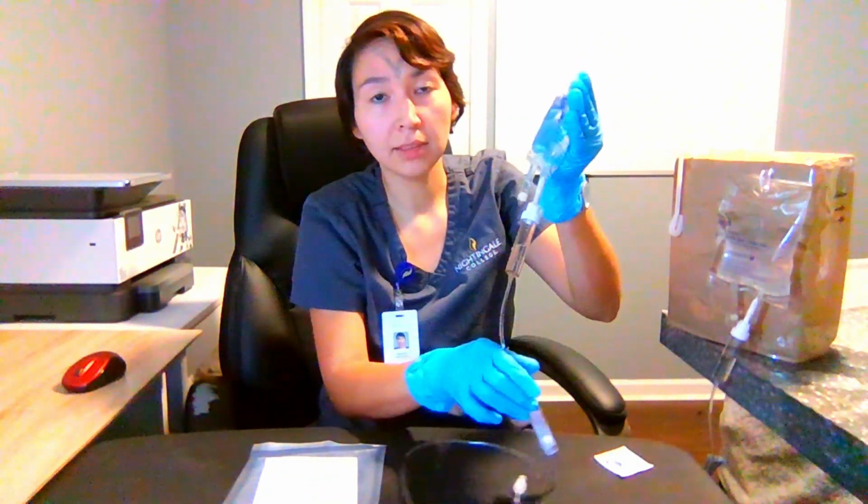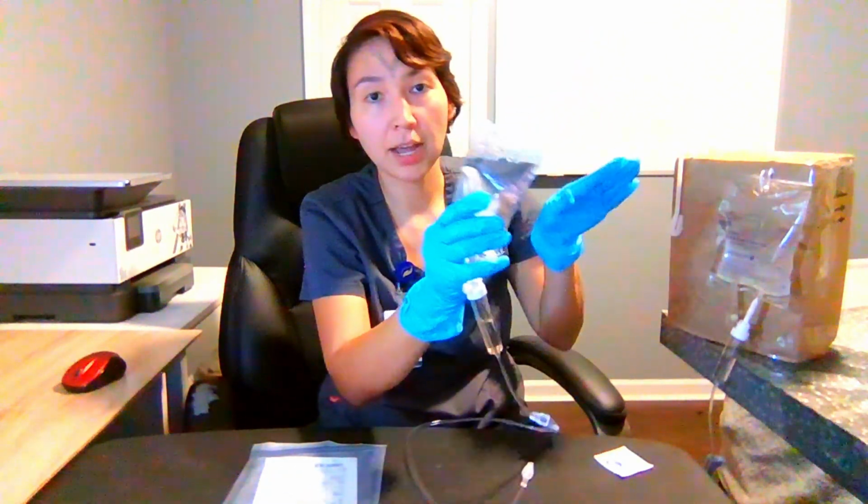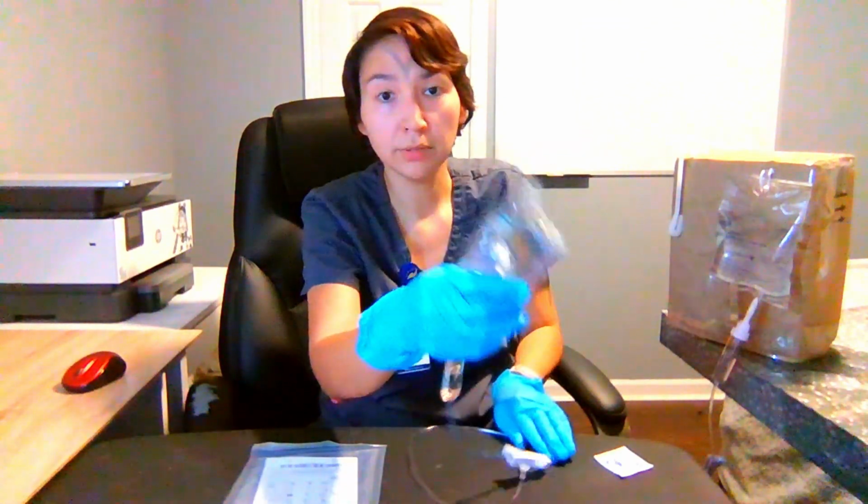I want to hang the piggyback medication higher than the IV fluid tubing.